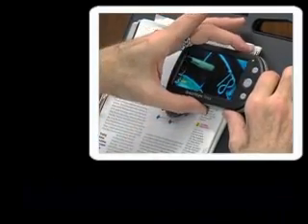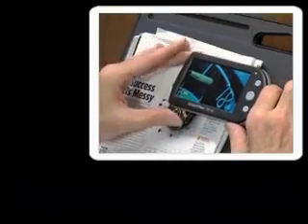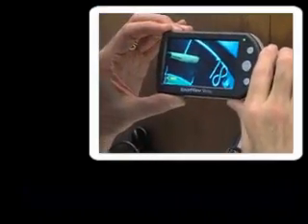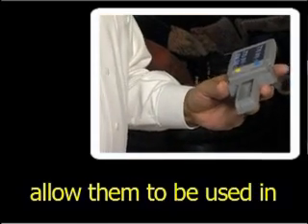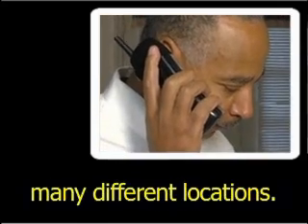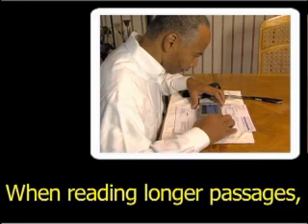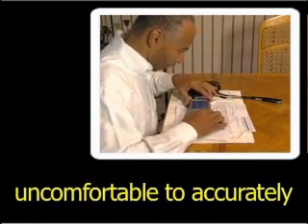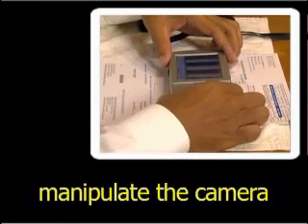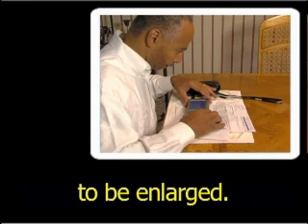A user lifts the unit off the material being enlarged. The enlarged image remains on the unit's screen. The flexibility of portable and pocket systems allow them to be used in many different locations. When reading longer passages, some users may find it uncomfortable to accurately manipulate the camera over the text or image to be enlarged.